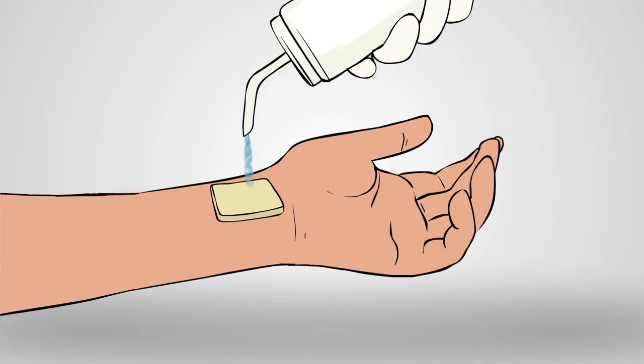Axiostat can be easily removed by irrigating with saline or water without further causing trauma or dislodging the clot.